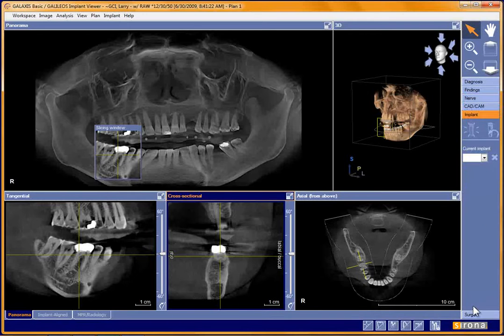CAD/CAM, implant planning, and to order surgical guides. If you have an implant in place, you could still print up a report form, but you couldn't order a guide without an implant license. In a later class, we'll go into the skills that all involve having a license.